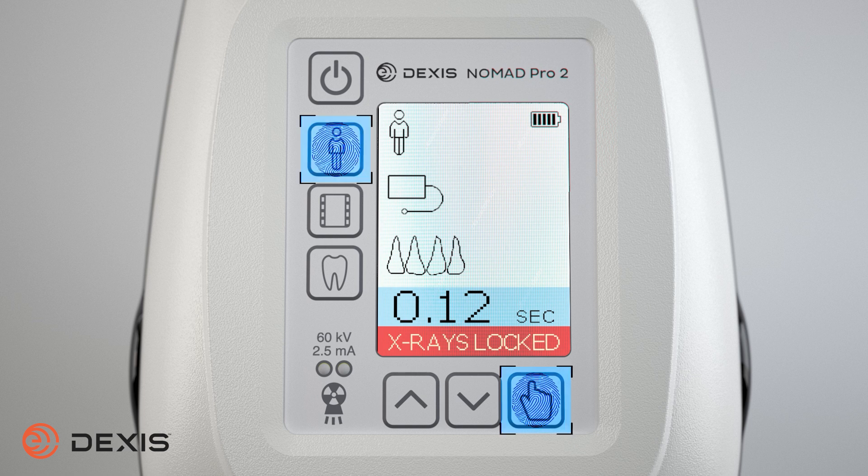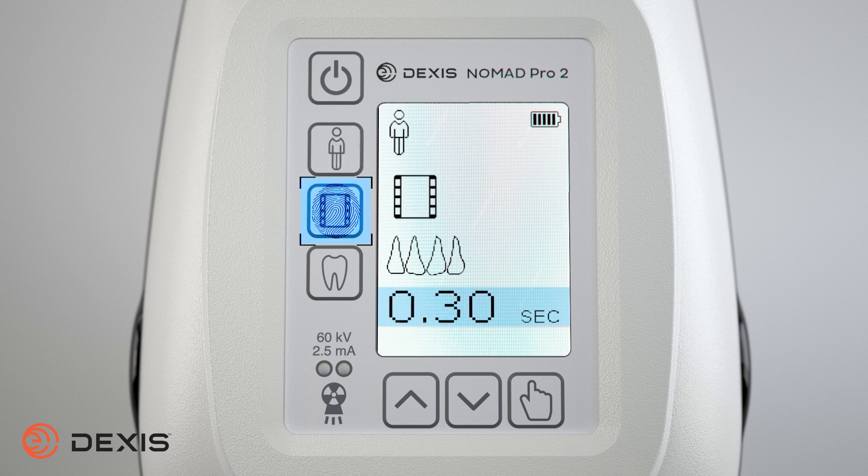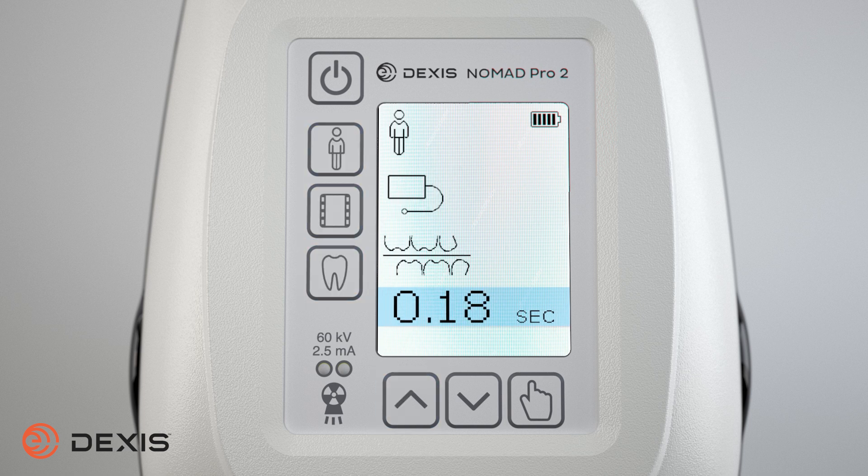Repeat this process to unlock the x-ray feature. Before taking an x-ray, there are a few safety features you should know. First, determine what settings on the Nomad will deliver the optimal results for the patient. This includes the patient's size, image receptor type, tooth group, and exposure time.